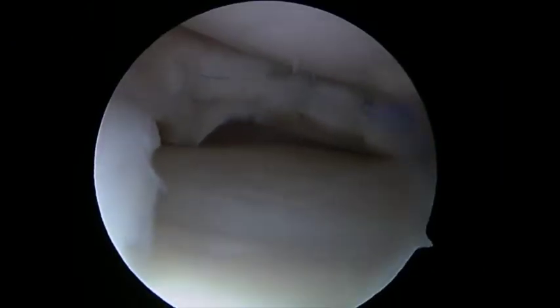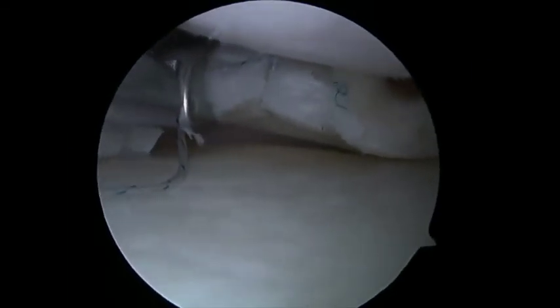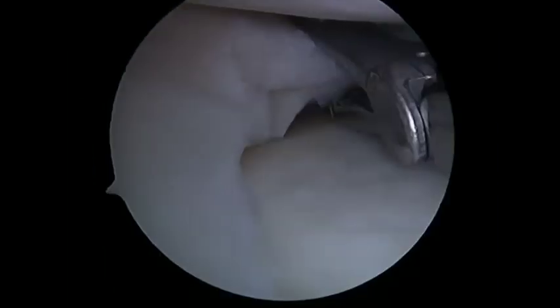The suture configuration created are circumferential compression stitches. As the repair advances from the posterior third of the meniscus to the mid body, the ipsilateral portal will no longer provide a perpendicular trajectory towards the meniscus tear. At this point, the passport cannula is removed from the ipsilateral portal and placed in the contralateral portal. The contralateral portal becomes the working portal while viewing from the ipsilateral portal.